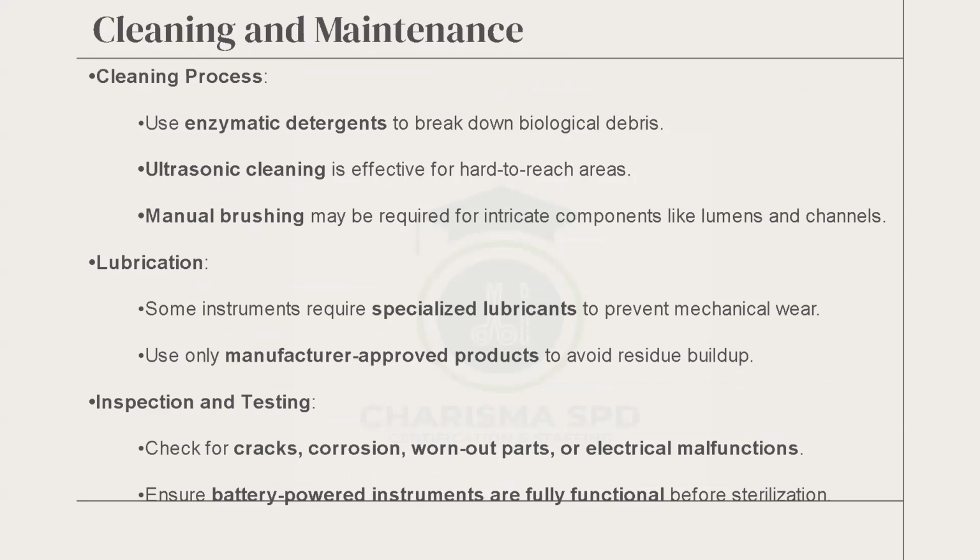Cleaning and maintenance. This is where the issue is. How do we clean it? How do we maintain it? Use enzymatic agents to break down biological debris. Because these drills are handled by the surgeon, the surgeon is the one who holds it and works with it, so it comes out bloody. So we have to use enzymatic detergents to break down those tissues.